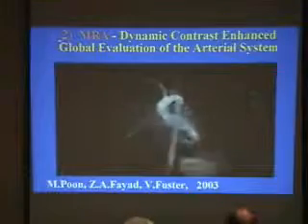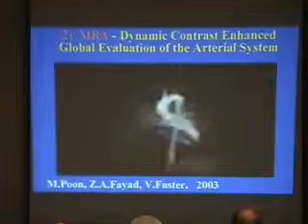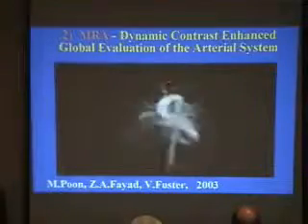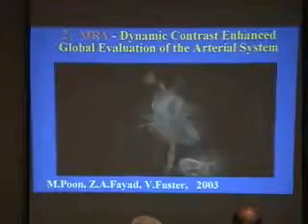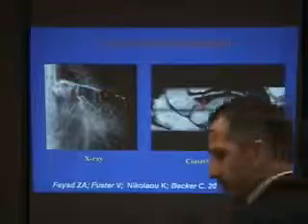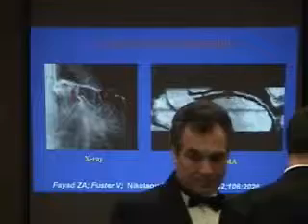Now we go to the second technology, MRA, which is basically to look with the computer. After you have done this, you can look at the different systemic arteries. The question that I like to answer today is, is there any future for MRA to the coronary arteries? And I like to give the answer, and the answer is no. I may be wrong, I may not be wrong.